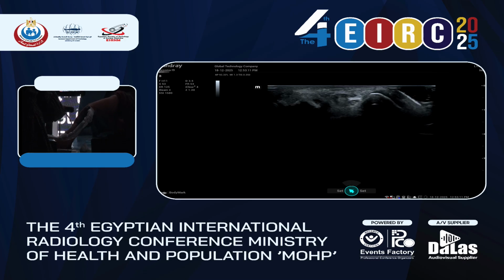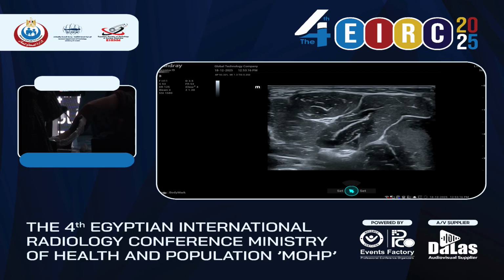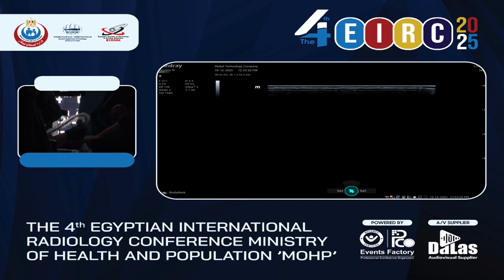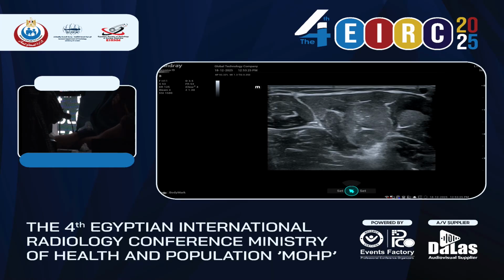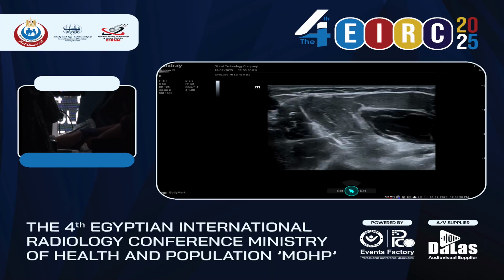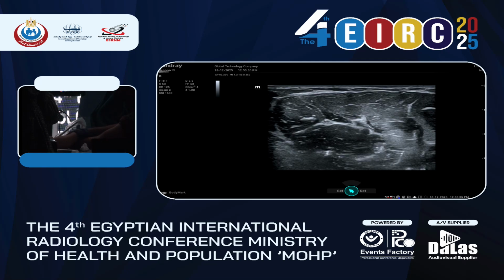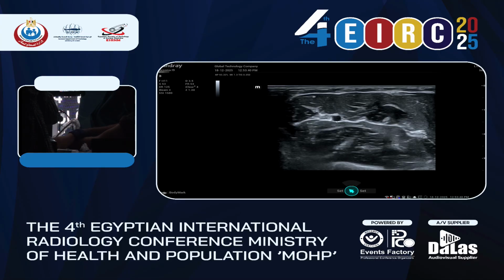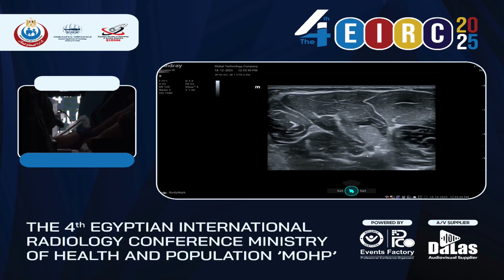As we move forward, gradually the nerve comes to the ulnar side. Then we ask the patient to put the hand like that, and we move our probe to the ulnar side of the forearm. So you see here that our ulnar nerve is alone without an artery. And when I move more distally, this artery comes next to the ulnar nerve. You see? This is the ulnar artery.